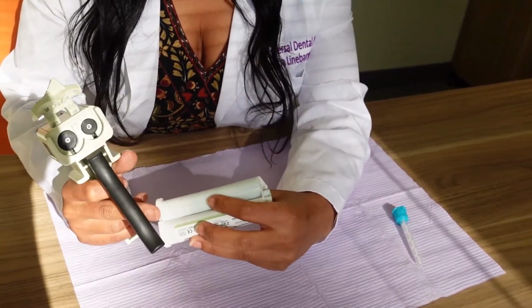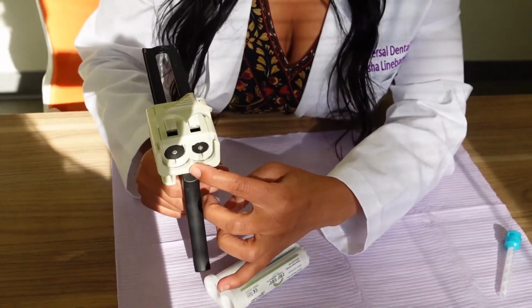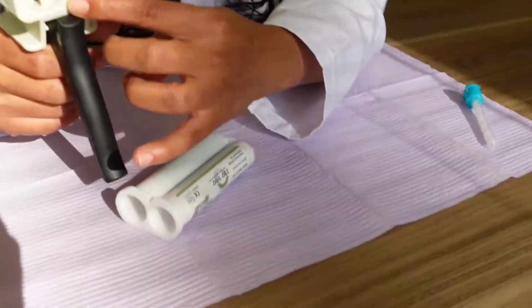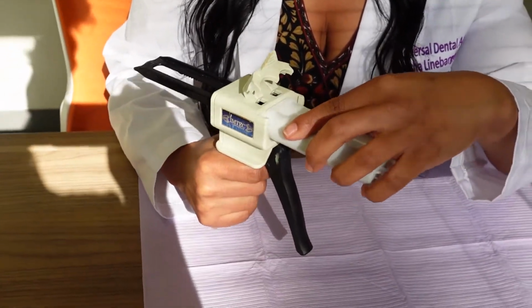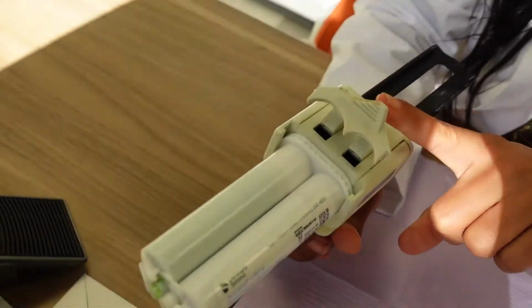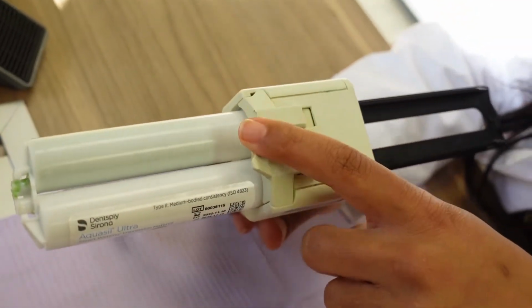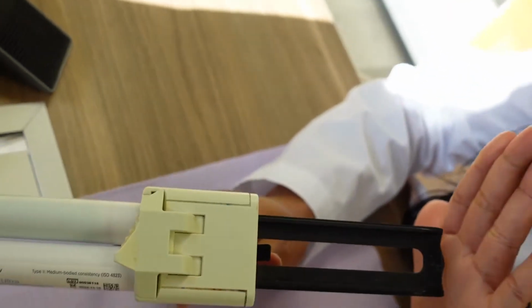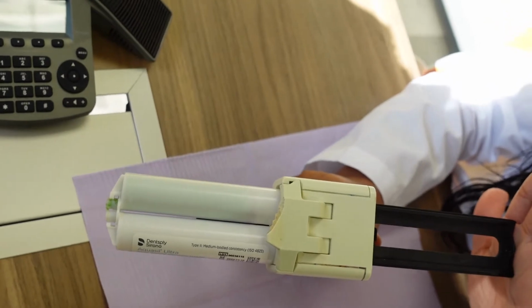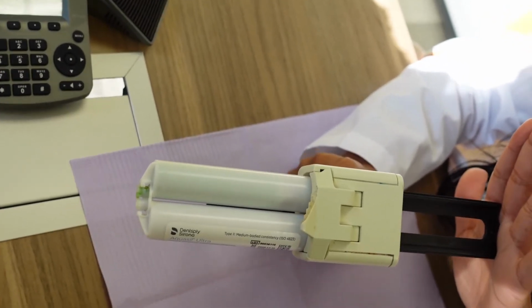See the notches here? The notches are gonna fit into this part of the actual gun. So here we go. We're gonna turn it into position. Snap it in. We're gonna close this. All right, just ignore this part because I broke the gun the other day. We're gonna close this, all right? And push this in. What it does, it tightens it. Push. So it stopped, right? That means we have a lot of material left.